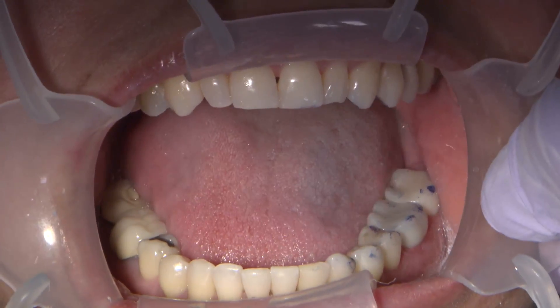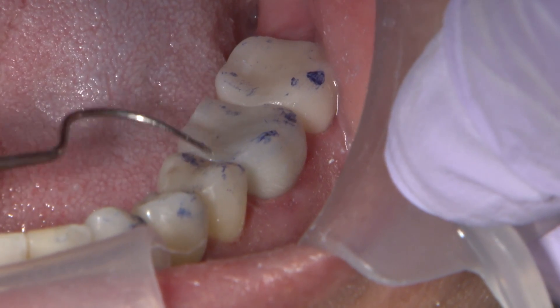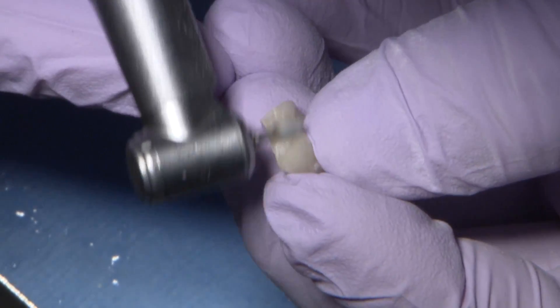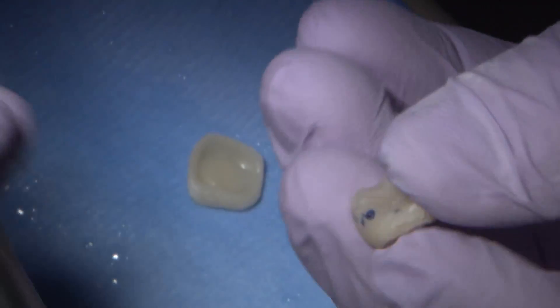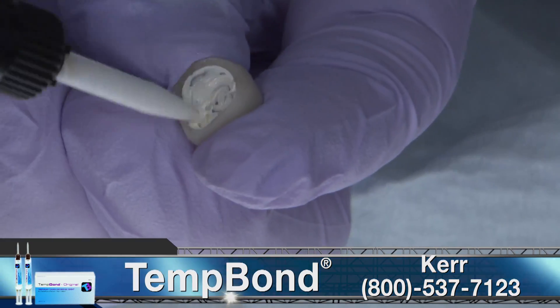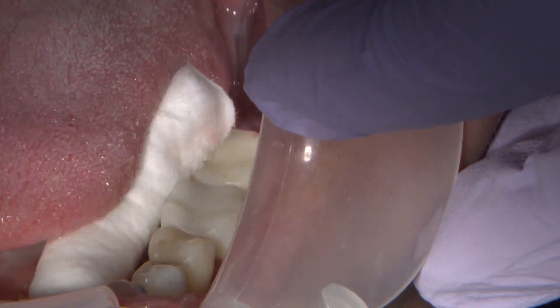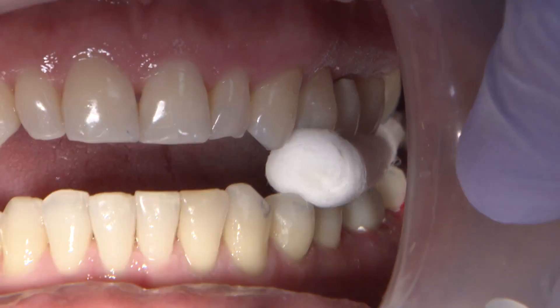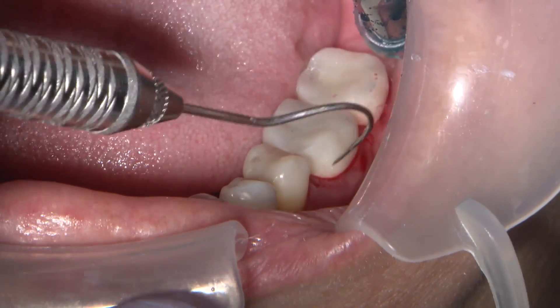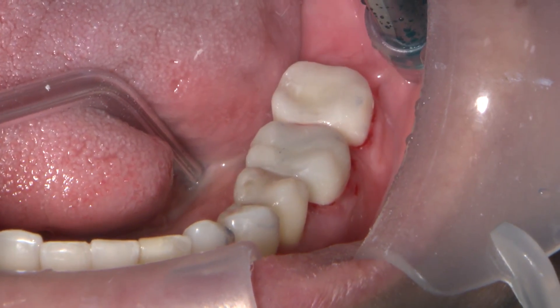There aren't any hot spots in my occlusion — the occlusion is nice and spread out on the bicuspids as well. This looks to be a successful reduction. I've gone ahead and separated these two units and checked the contacts in between, showing that we can do separate units as well as single units depending on what you want to achieve with your patient. While placing temporary cement, I put just a little bit on the flat surface and a little more around the edges of the intaglio. That way, when you put the temporary on, all the excess moves out from the sides and doesn't get stuck underneath causing the temporary to be high. Place back in the mouth on the dry preparations, check that a little has extruded from the sides, and allow the patient to bite on cotton for the appropriate time.